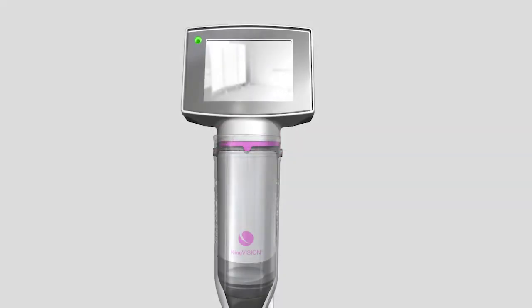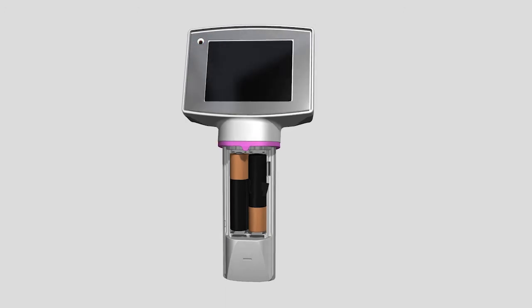When the LED indicator light on the top left of the display is green or off, the display is ready for use. When the LED is flashing red, the batteries need to be replaced as soon as possible.